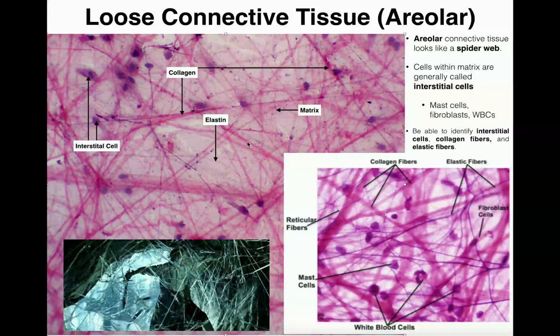Now, in contrast, the elastic fibers, or elastin, are much thinner. In this picture down here, they're going to be dark purple. They're also that way up here, but you can tell they're a lot thinner or skinnier than the collagen fibers. The dark purple ones that you can barely see are very thin, like this one where the arrow is pointing. This one is actually an elastic fiber. We have another one right here where I'm tracing my mouse. This dark, very skinny purple fiber is an elastic fiber.